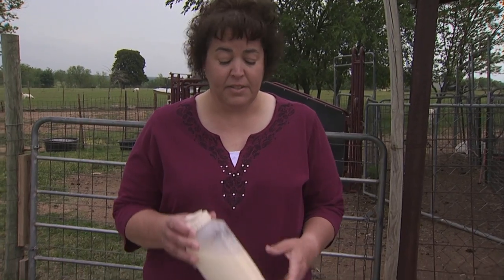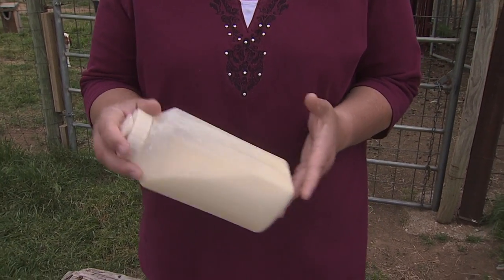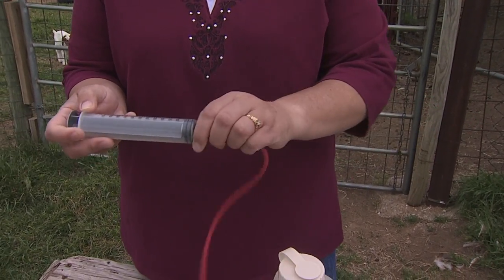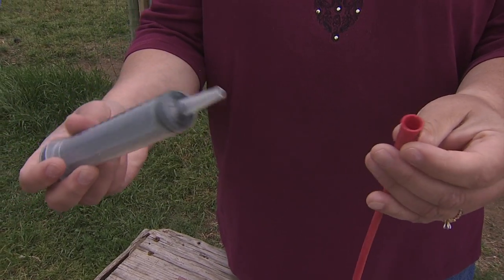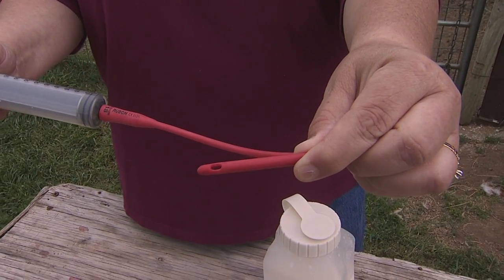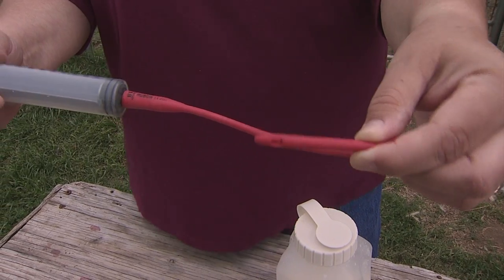First thing you need to do is have all of your stuff together. You don't want your assistant to hold the goat while you fumble around looking for the syringe — you need to have everything together. What you'll need is a milk replacer, or whatever you're wanting to get into that goat — okay, medicine or anything else. This is a syringe with a very long nose on it, made for this purpose. This tube has a hole at the end of it and is available at any vet supply catalog.